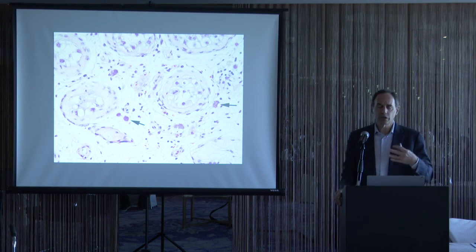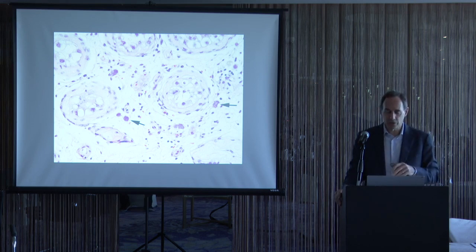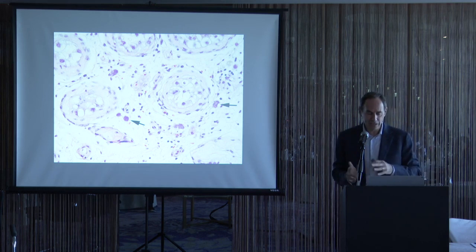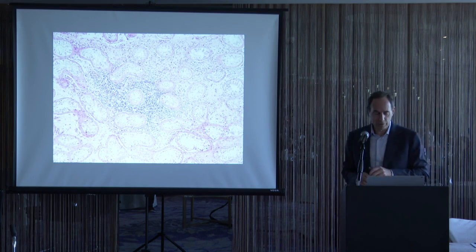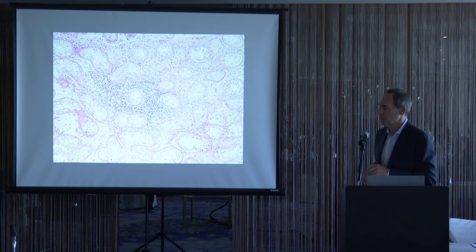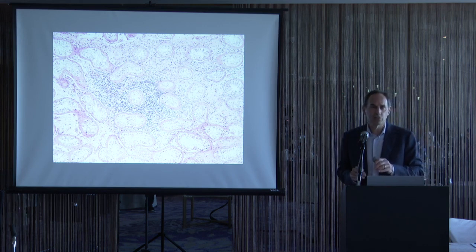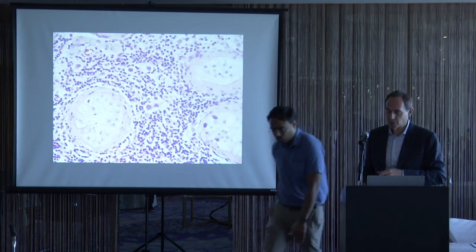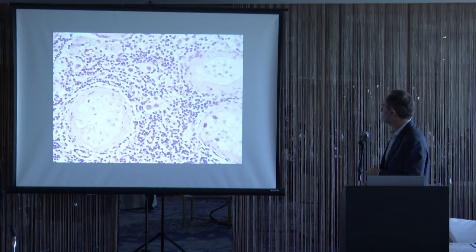So the time I start looking for intertubular seminoma is usually in cases where there's very extensive germ cell neoplasia in situ. That's the typical scenario where you'll see this microinvasive intertubular seminoma. The other clue, in addition to extensive germ cell neoplasia in situ, is that at low magnification, if you see an area with a lymphocytic infiltrate, you want to go to higher magnification, because in the normal testis, one would not expect to see a lymphocytic infiltrate. And when one goes to higher magnification, you can recognize the scattered intertubular seminoma cells.